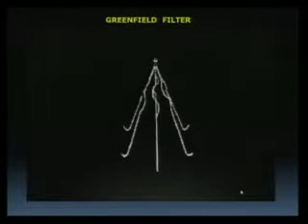This is the Greenfield, so let's take a look at the prototype. This is the basis of all the designs of the filters. It is a partially open umbrella. There are 6 legs, and there is a hook at the base of the leg that will partially hook into the wall of the IVC. And this is the apex. You will see this is the reason why, because of the laminar flow of the blood, the clots are trapped as they go upstream into the apex of the filter.